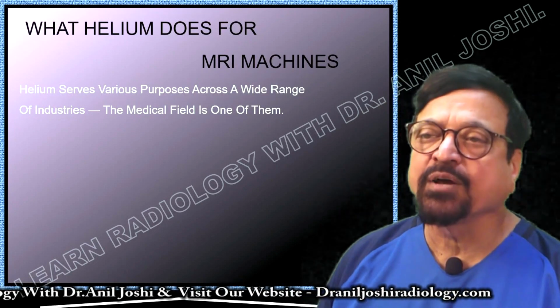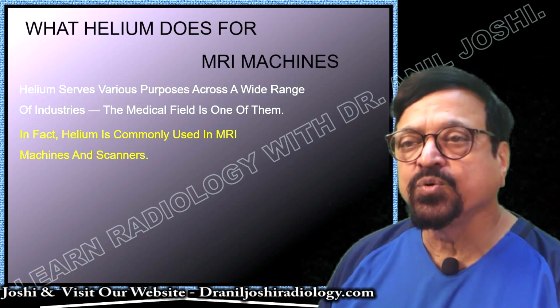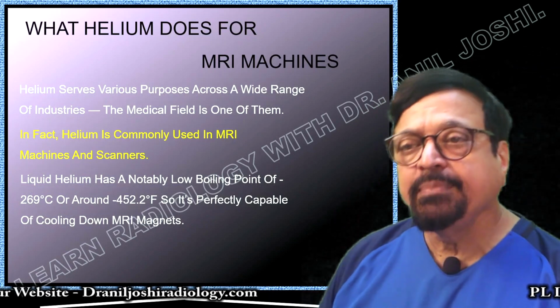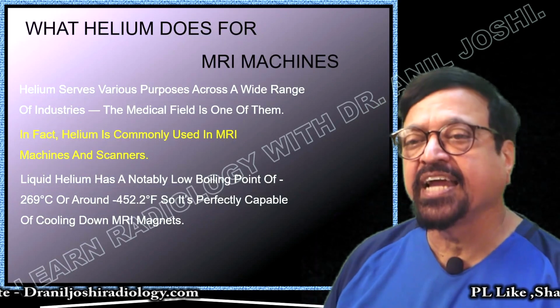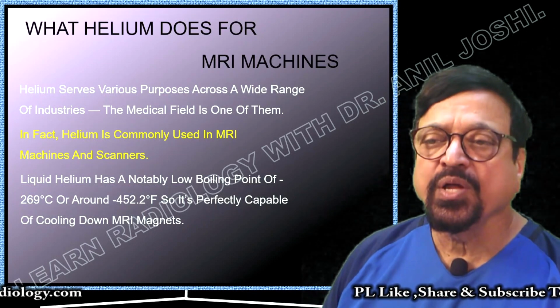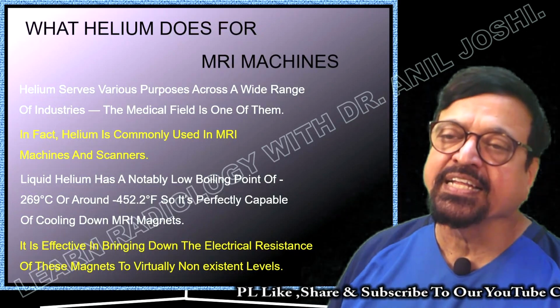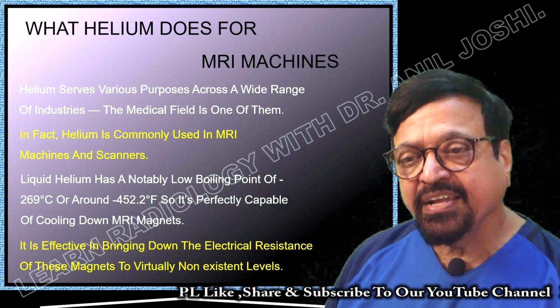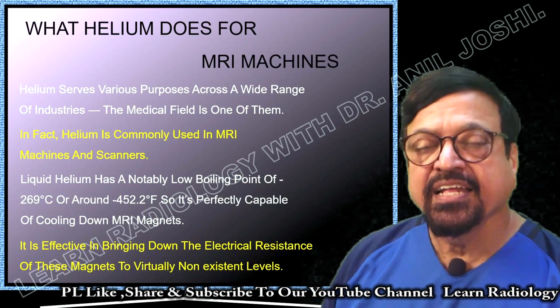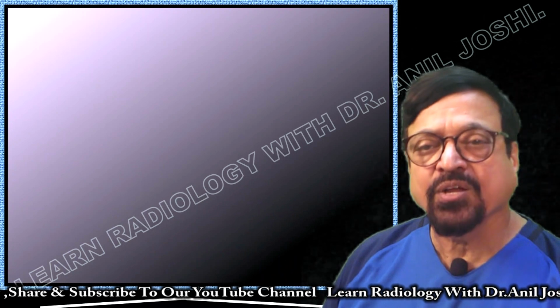Helium serves various purposes across a wide range of industries, not only medical. The medical field is one of them. In fact, helium is commonly used in MRI machines and scanners. It's true. Liquid helium has a notably low boiling point, that is minus 269, which can also be called minus 452 Fahrenheit. So it is perfectly capable of cooling down MRI machines. That's why it is used in the refrigeration system of MRI. It is effective in bringing the electrical resistance of the magnets virtually to zero, so there are no electrical losses.